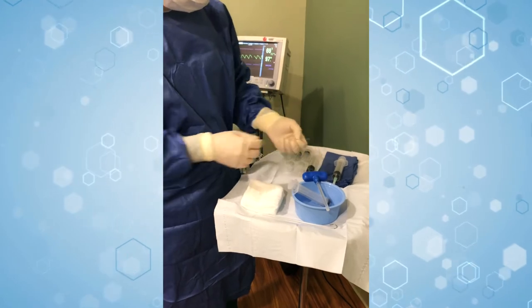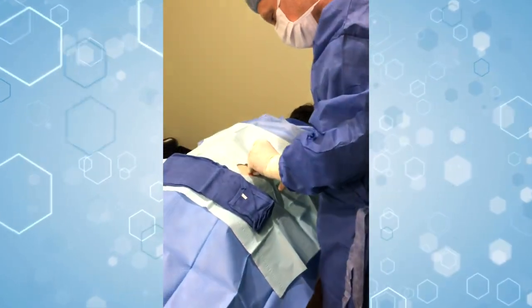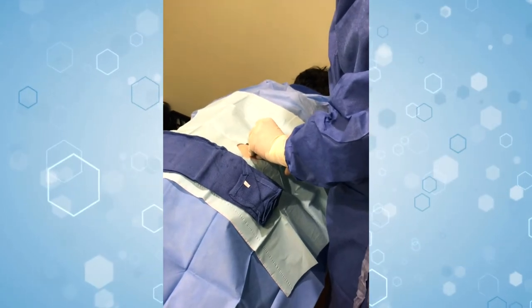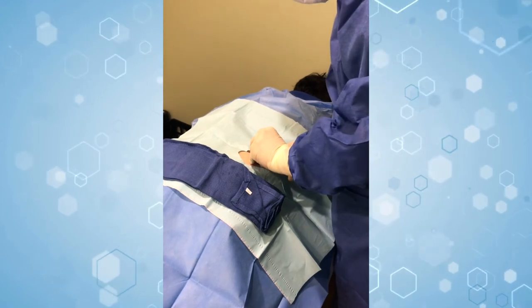So we're going to take this and just make a little small stab incision right here where we numbed up. Just a little stick — that's it. Did you feel that at all? No. So yeah, you can see she's very comfortable.